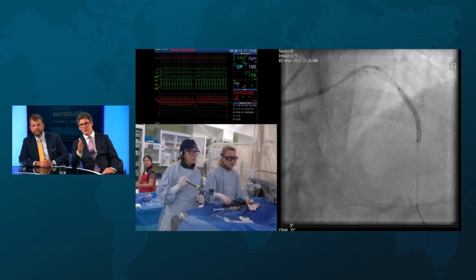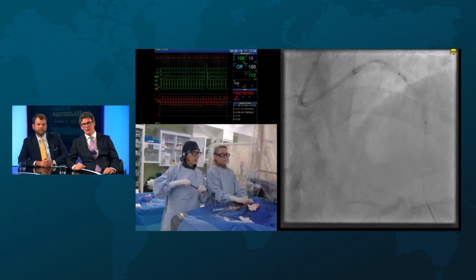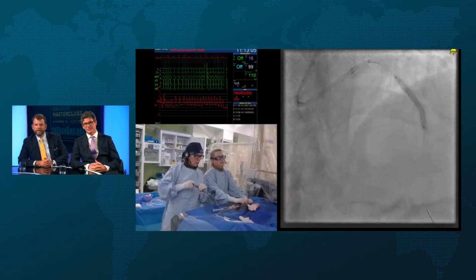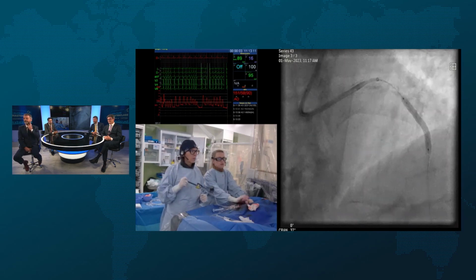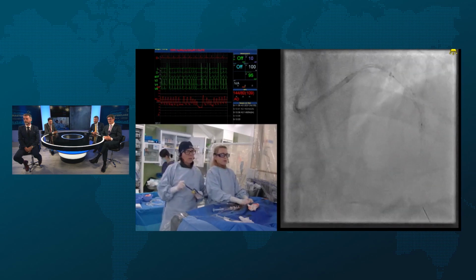Lovely example here. It's a long stent, isn't it? The expansion was almost completely even along the length, with a little bit of restriction at that nodular section. Even just seeing how the stent delivered. Think about what that vessel looked like before we got started. Remember, there's no atherectomy here. This was IVL. I'm going to take the guide extension out and wire quickly. So you saw the case.